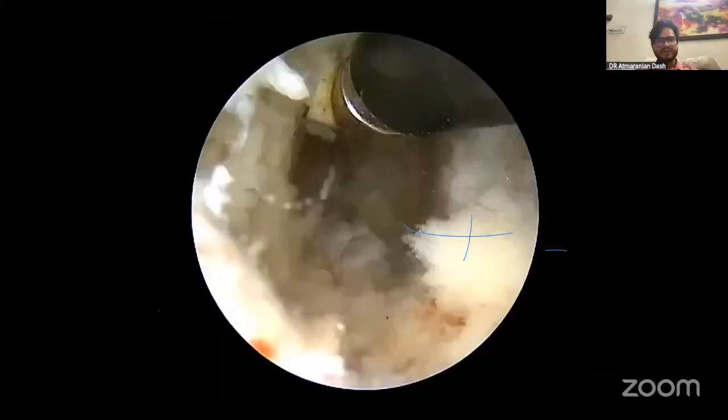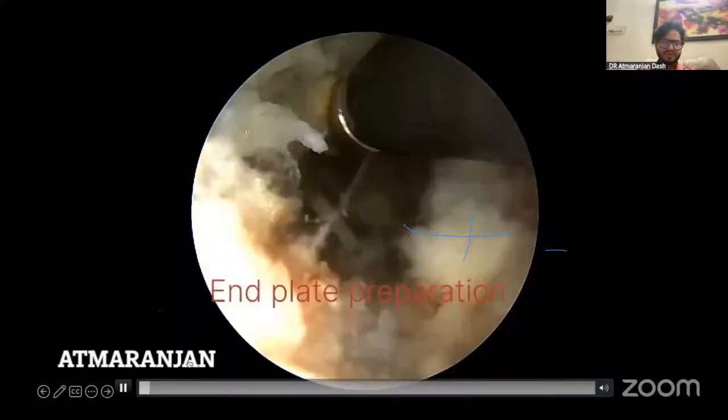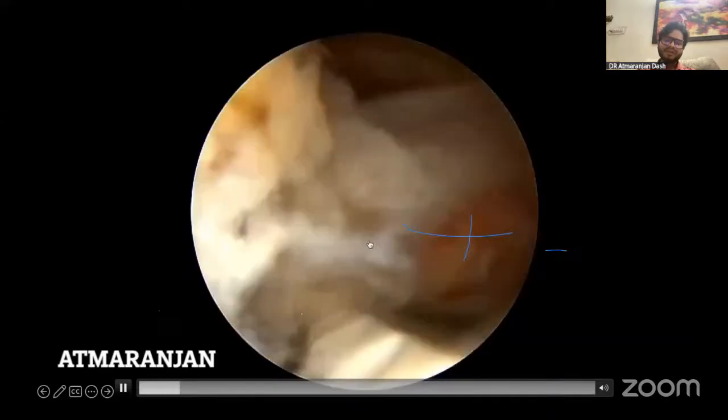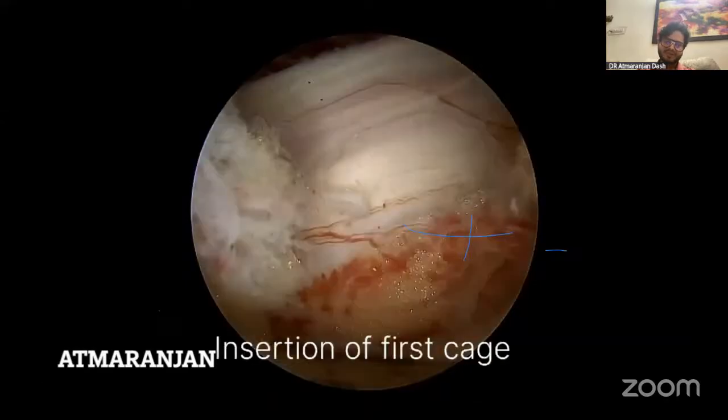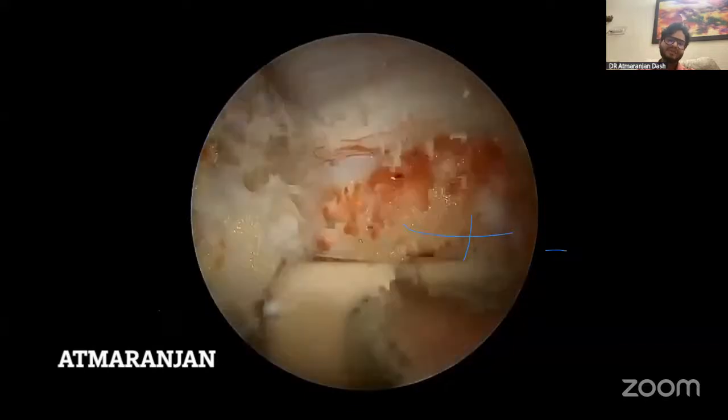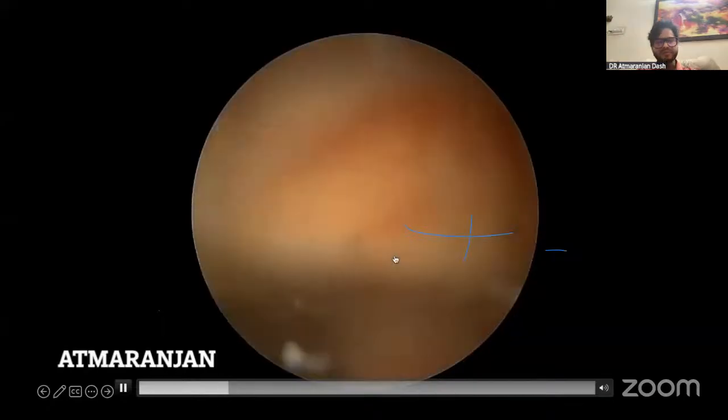This is how we do the end plate preparation, and you can see the very well prepared end plates. I tried to put two cages in open surgery and microscopic surgery. I find it very difficult, but it was very easy in biportal endoscopy because your eye goes very close to the discal space.